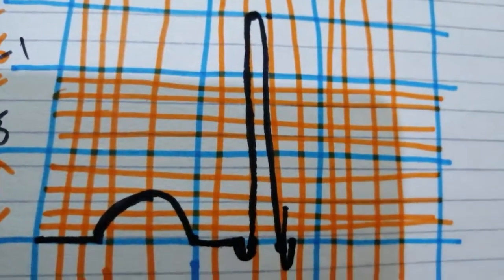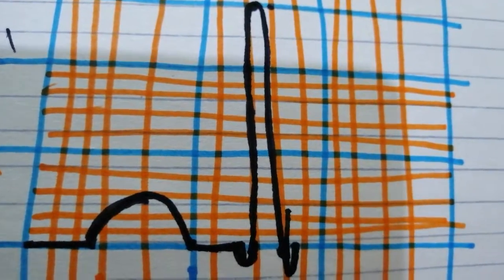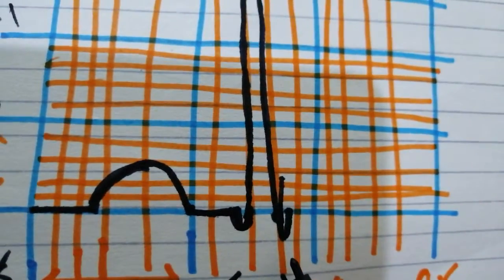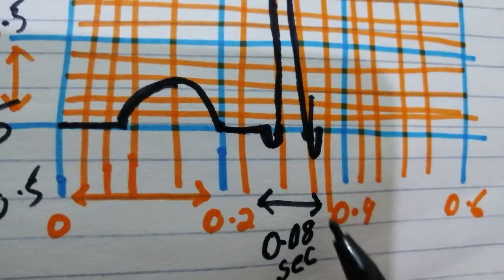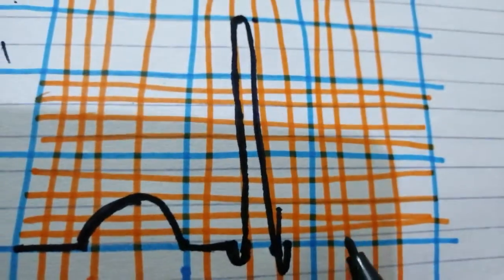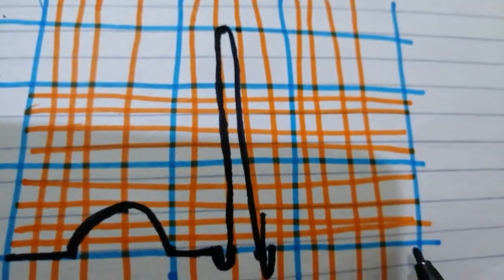Now we will have another segment and another interval, the QT interval and the ST segment. Segment is just the isoelectric portion, and the interval in total covers about 0.35 to 0.45, so I'll go with that. 0.35 minus 0.08, it's basically 0.3 minus 0.03, 0.27, I guess. I'm so bad at this.